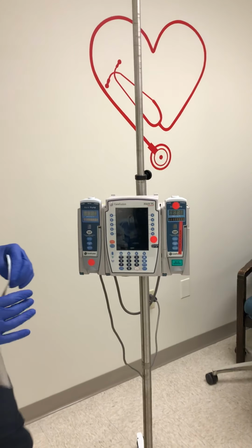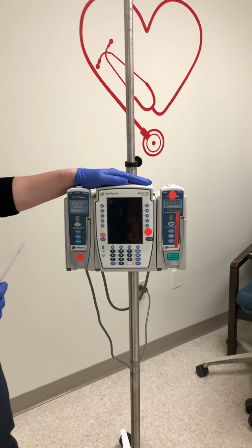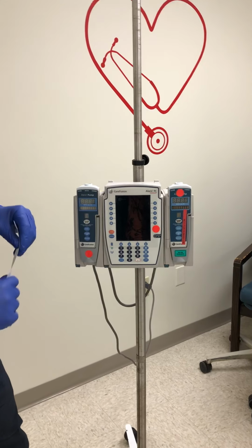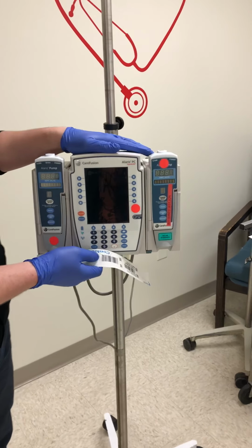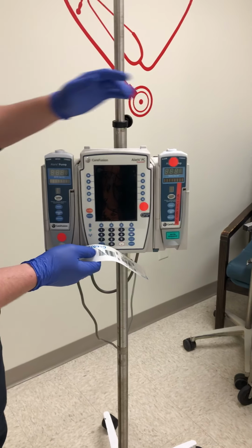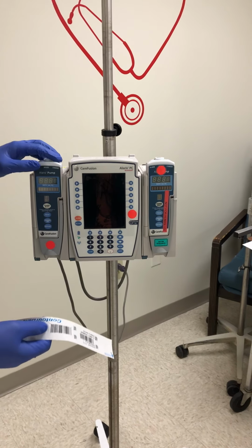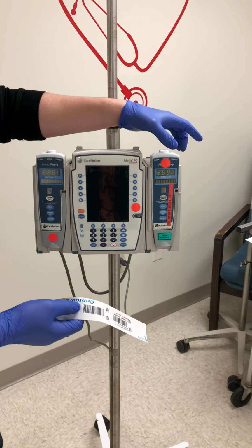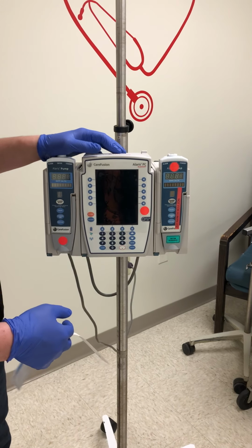Now we're going to do a tutorial on the Alaris IV pump that we have over at main campus here at Firelands. The setup that you'll have is the middle part, which is called the brain of the IV pump, and then you have a channel that's connected to each side. This pump can hold up to 4 channels, so you can have 2 channels connected on each side, and I'll show you how those are shown on the computer once we turn that on.